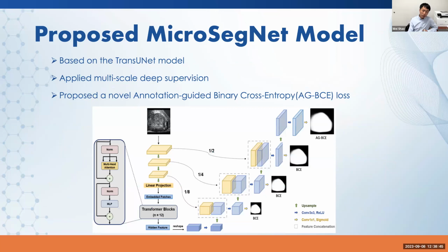The difference between the final annotation from our expert and the initial annotation from our students tells the model where exactly are the regions that are hard to segment. The regions where the student missed it but the expert found it are hard to segment for the models.